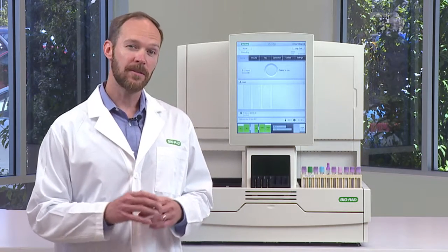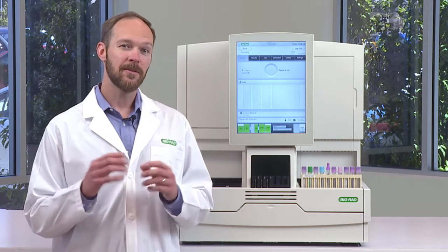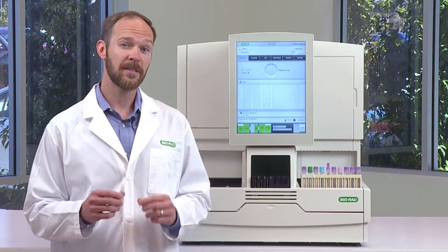Thank you for joining me on this tour of the D100 hemoglobin testing system, and learning how to get more done with its efficient workflow.